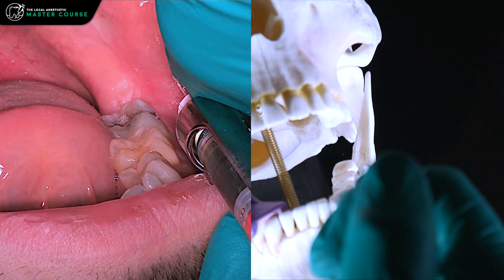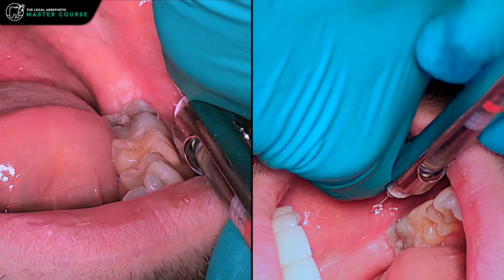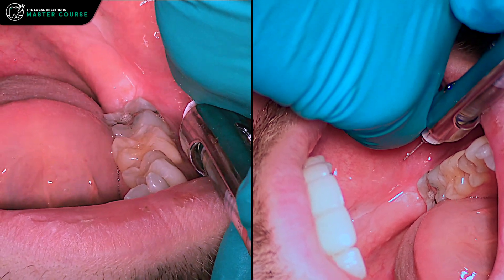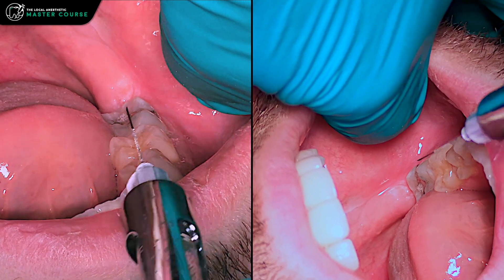Rotate, deposit a little more, aspirate again — looks good. You can put in about 0.6 mL, which is the recommended amount. Oftentimes I'll do about 0.9 mL if I'm doing oral surgery back here, just to make sure the patient is very comfortable.